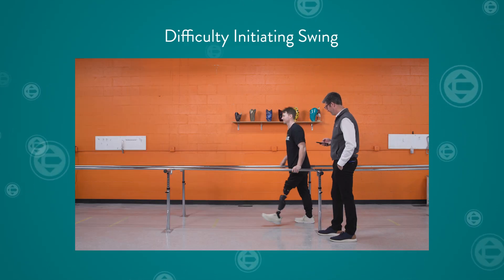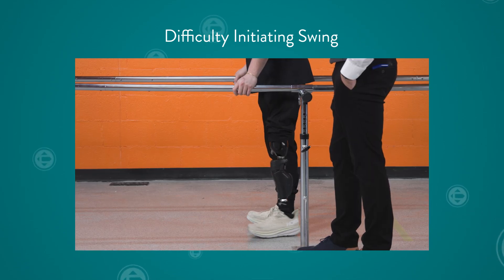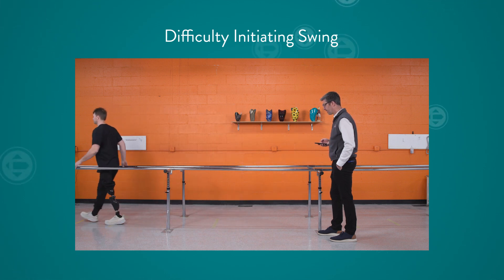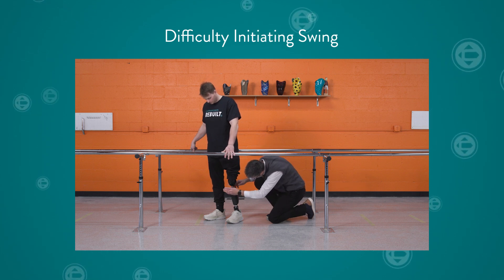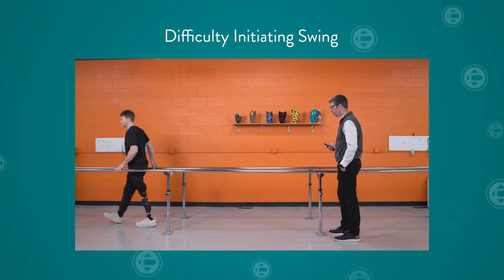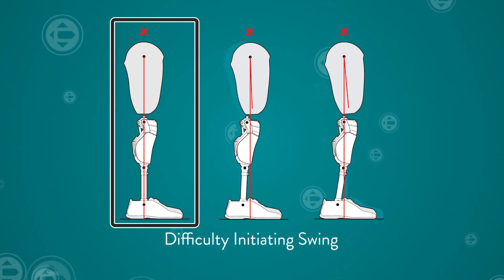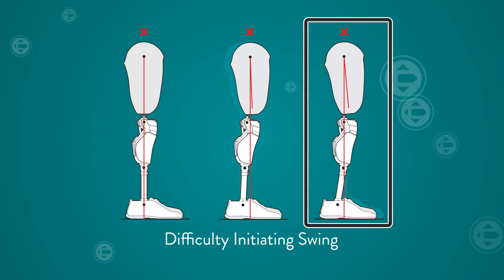If the user has difficulty initiating swing, an alignment issue could be preventing them from meeting the full extension parameter. First, check the location of the load line. Ensure the knee is vertical at mid stance. It should not be tilting backward, because this means the user will not be able to, or will have difficulty meeting the forward tilt requirement. In this case, the load line is too far posterior and should be moved more anterior. Other alignment-related issues that may lead to a user not meeting full extension include insufficient socket flexion, excessive foot dorsiflexion, or a foot position that is too posterior relative to the knee and socket.